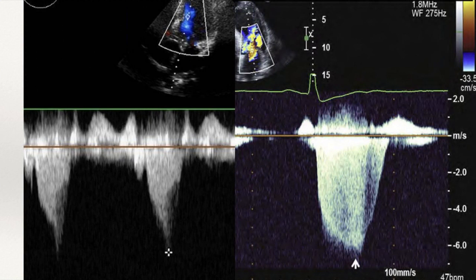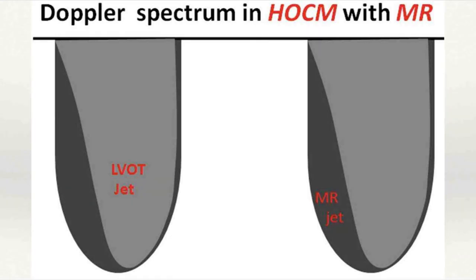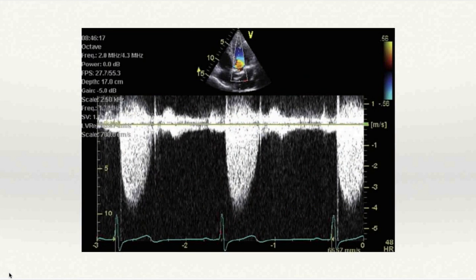Differentiating LVOT obstruction Doppler from MR: with MR, the Doppler starts at the beginning of systole with the QRS and has a more parabolic or bell-shaped profile. For the LVOT gradient, it starts during mid-systole and is dynamic — velocities increase as there is more obstruction going into systole, giving the characteristic dagger shape. For aortic stenosis, the Doppler is also parabolic, not dagger-shaped. Diagrams show both the LVOT jet and the MR jet superimposed, highlighting their distinct profiles.